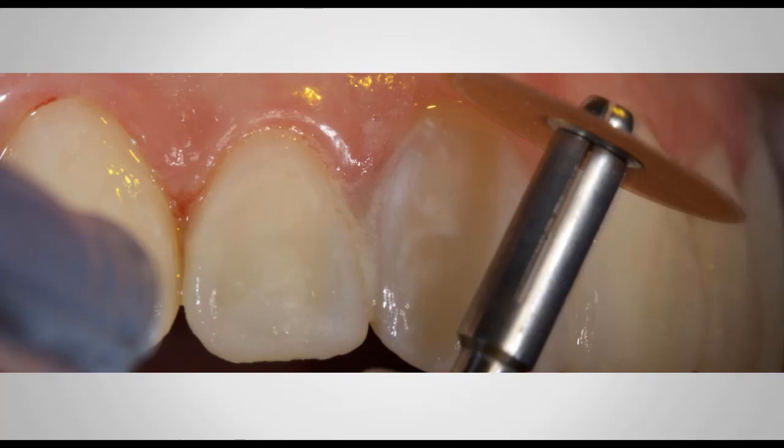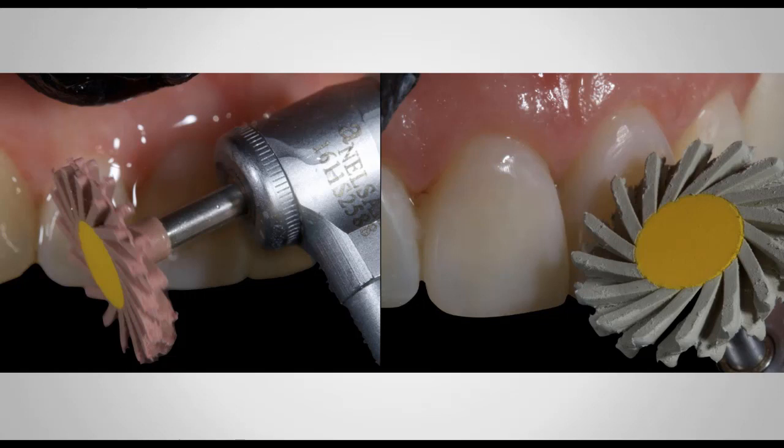I want to make sure that there's no gingival inflammation the whole time that the patient is using the prototype. And then after that, I just polish it, and there are many things that you can use to polish it. I only use the Softflex system, the medium coarse, just to go around the margins and get very nice and smooth margins. You can see this is tooth structure. You can see the line of the flowable composite, almost invisible, almost imperceptible. But you can see that this is the actual tooth structure of the patient.